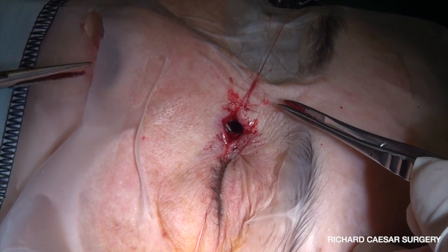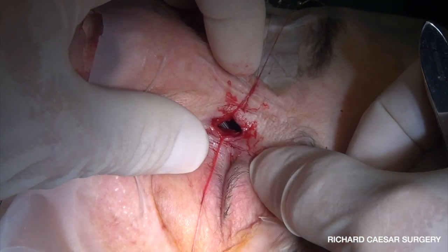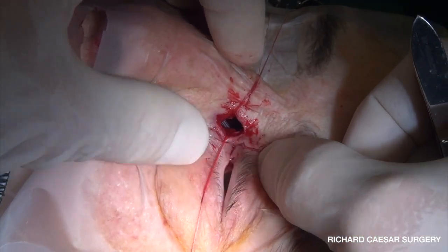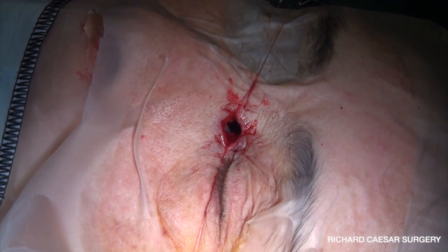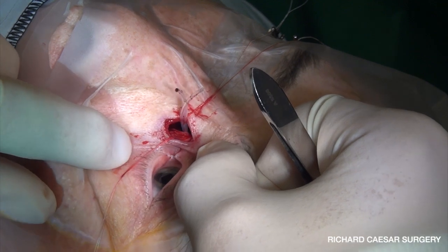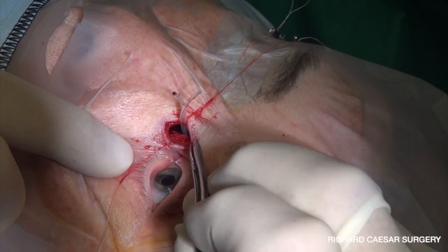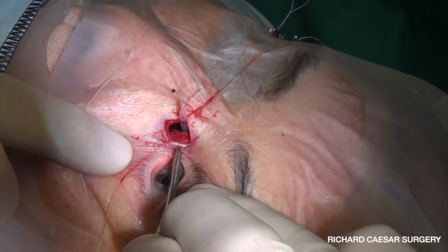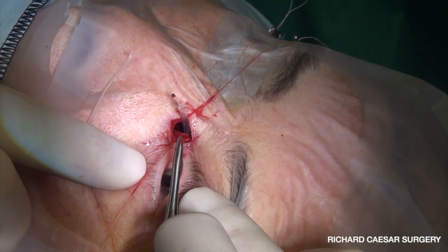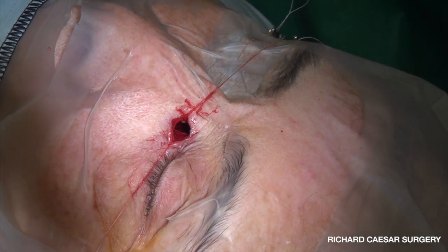You've done your DCR and put your silicon intubation in. You're going to leave that silicon intubation in for between two and six weeks — by preference some people take it out sooner, some leave it in a bit longer. Here's where it all gets fun: when the patient comes back to you in clinic, to remove this silicon all you're going to have to do is pull it directly back out by hooking the loop from between the puncta, and with a little bit of pressure it will slide back out. It should be as simple as that.